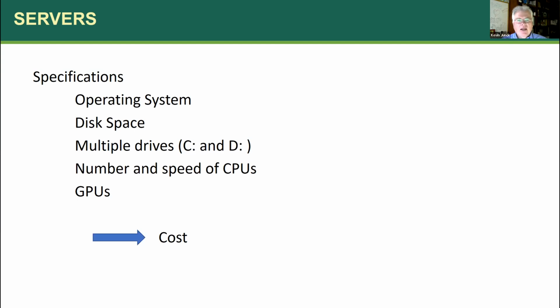The D drive has all the vendor specific stuff. Well, some vendors are okay with that. And other vendors say, no, we haven't really developed our software that way. We need access to put our software onto the C drive. So these are the sorts of things you need to think about, and you've got to negotiate between your IT department and the vendor.